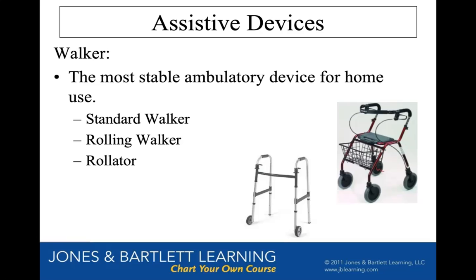So if you have somebody that's just learning to walk, or they can walk and they're real shaky, or they have to have somebody with them for balance, don't give them a rollator, because they're going to be gone on the floor. Those wheels are going to just roll out from under them. I would give them a rolling walker with 2 wheels, because it's slower to use. You have to push it. It's harder to use, and it's better for people that have to take it slower.